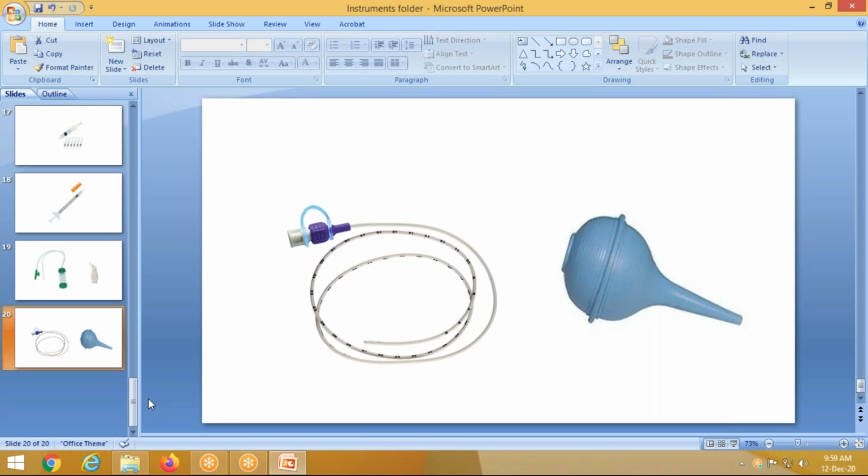And also in pneumothorax, you can attach it to the butterfly needle, and for instillation of the medicines, that is the indication. And syringes also of different sizes you can get: 5 ml syringe, 10 ml syringe. You can see the back side of the syringe and you can tell the syringe.